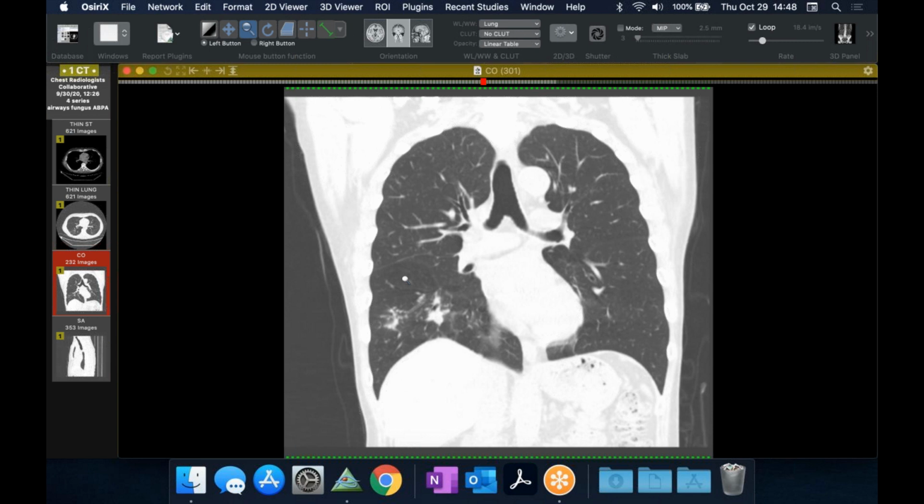No asthma, no cystic fibrosis, but he's got this big blob here, and on the bronchoscopy they did notice some thick, tenacious secretions, and he reported later, when he coughed up stuff, it was pretty thick. So the question was, and we reviewed this in a multidisciplinary conference, is this ABPA or is this something else?